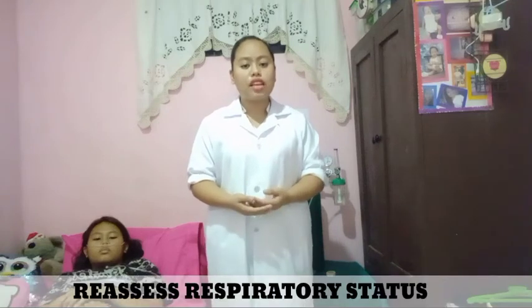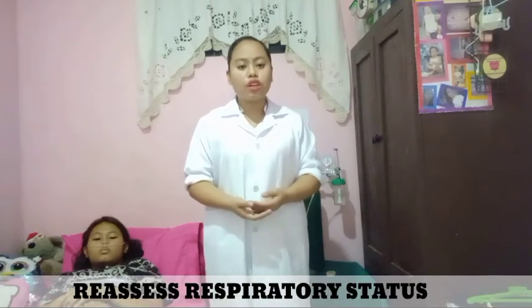And then, assess or reassess the patient's respiratory status, including respiratory rate, effort, and lung sounds. Note any signs of respiratory distress, such as tachypnea, nasal flaring, use of accessory muscles, or dyspnea. Remove PPE if used, then perform hand hygiene and document.